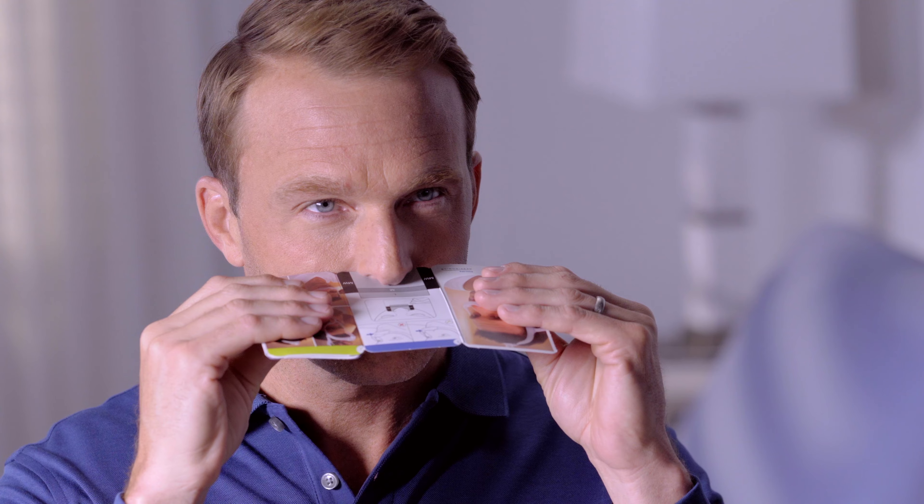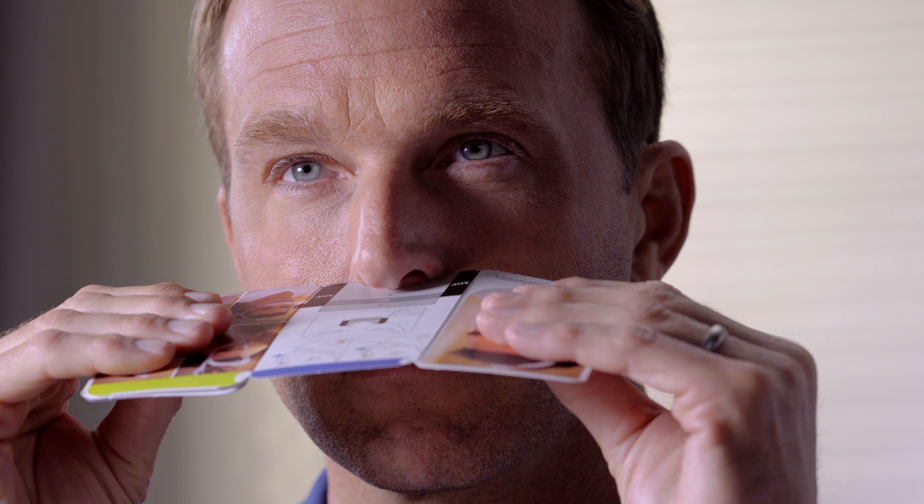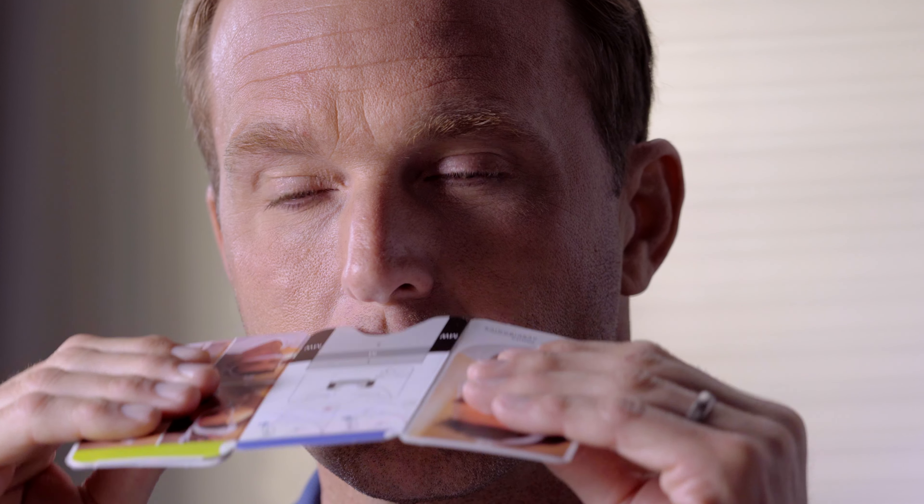Standing in front of a mirror, hold the gauge horizontally under your nose. Choose the smallest size that will cover your nostrils and tip of your nose. In this case, a medium.